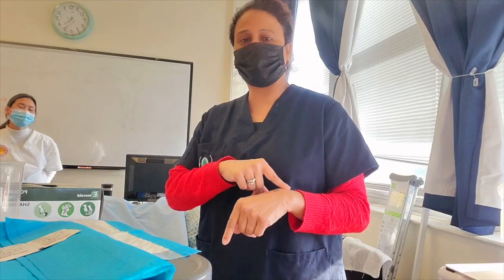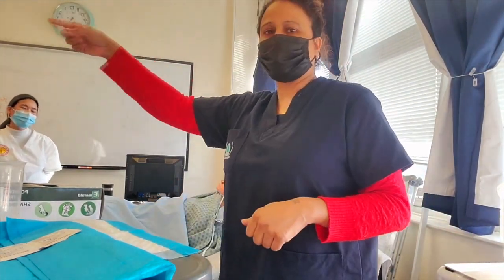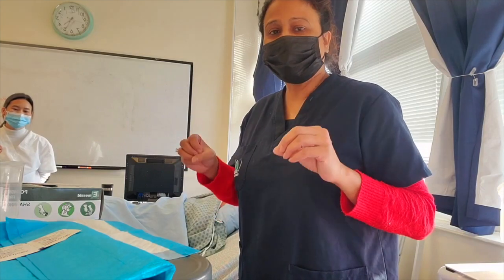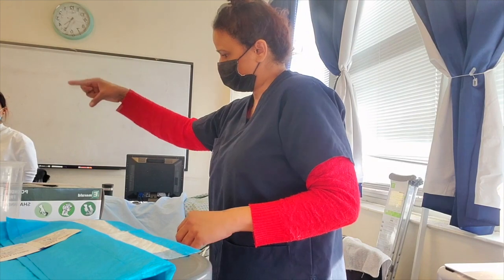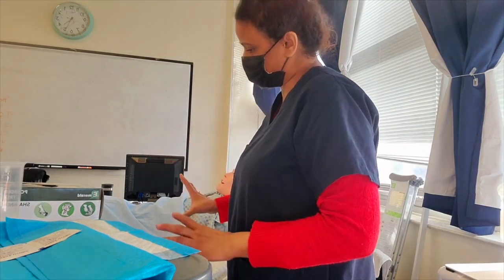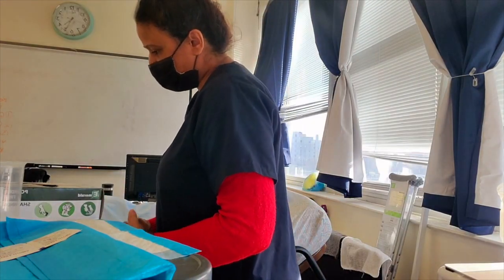The next thing I want to do is pull my privacy curtain. You draw the privacy curtain because you have to maintain the dignity and privacy of the patient.